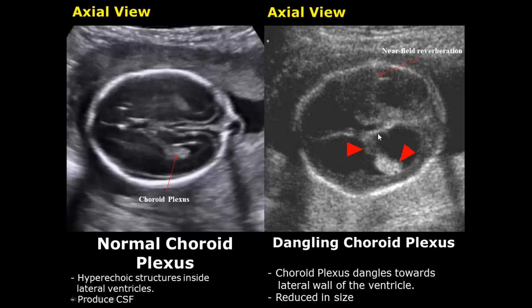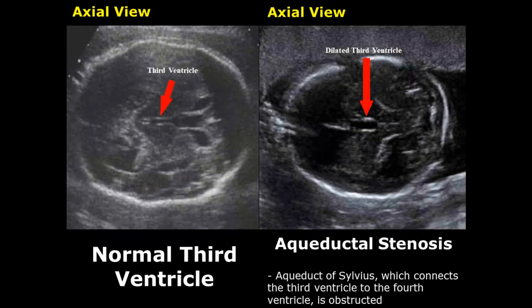In dangling choroid plexus, the choroid plexus will be reduced in size and will appear to float or dangle inside the lateral ventricle. In aqueductal stenosis, the aqueduct of Sylvius — which connects the third ventricle to the fourth ventricle — is obstructed, leading to dilatation of both the third ventricle and the lateral ventricles.